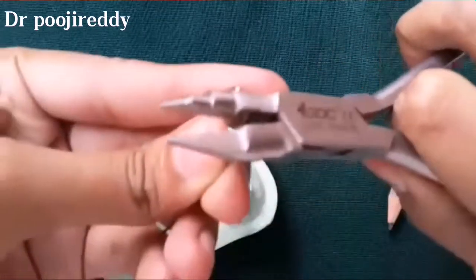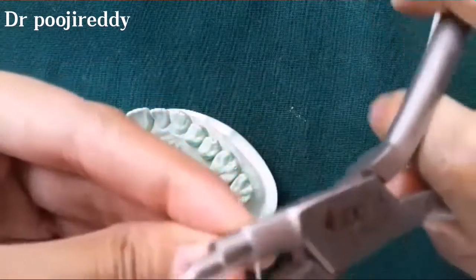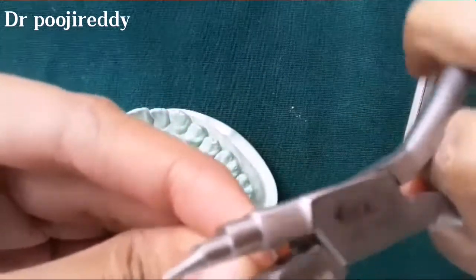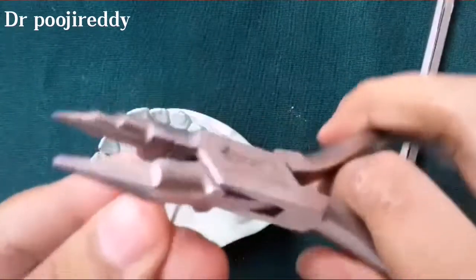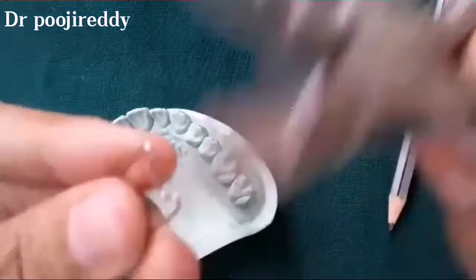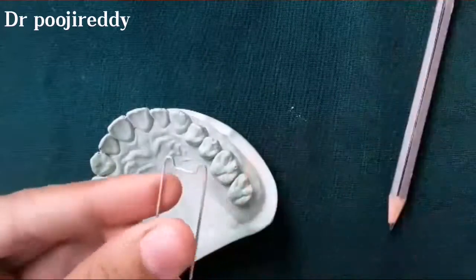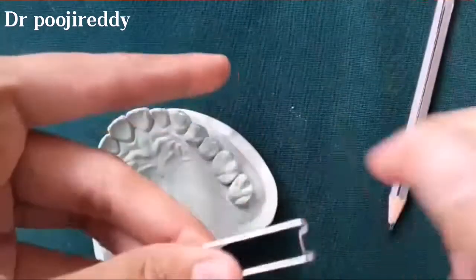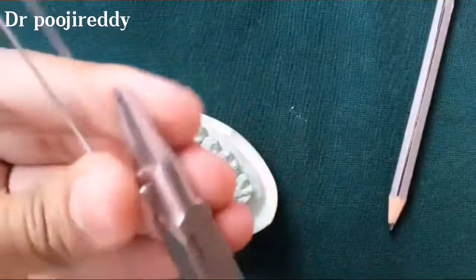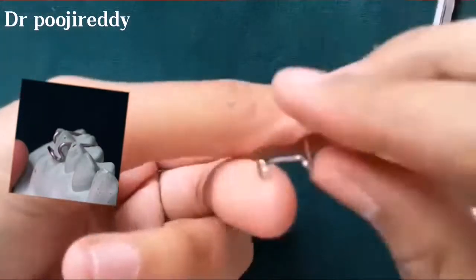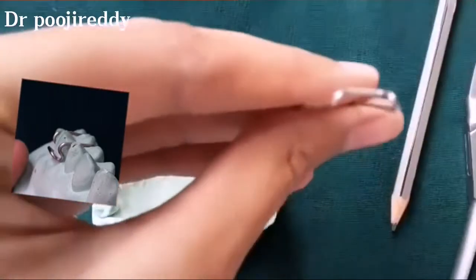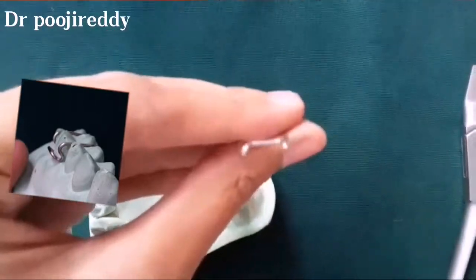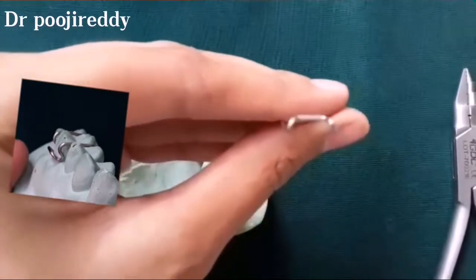Now close in the arrowheads so that the arrowhead will be as pointed as possible. Now the arrowhead is given a 45 degree twist so that the arrowhead will be 45 degrees to the bridge of the Adams clasp. It is clearly seen right now.